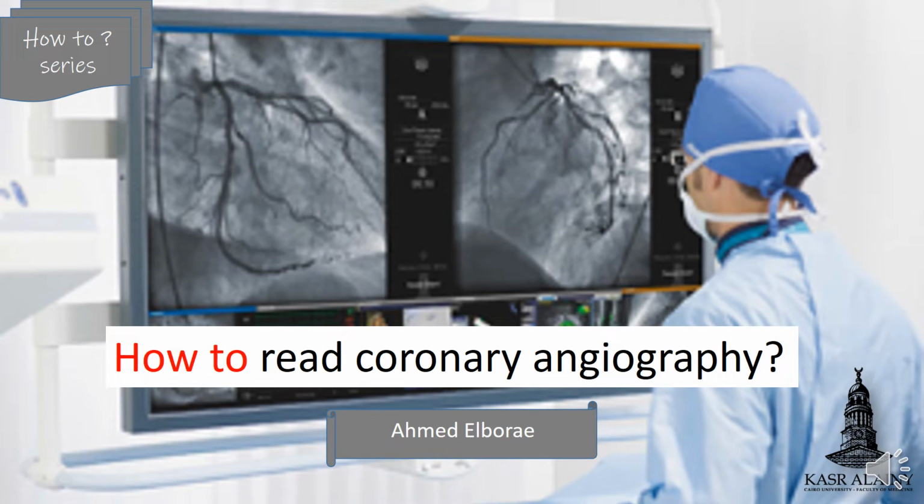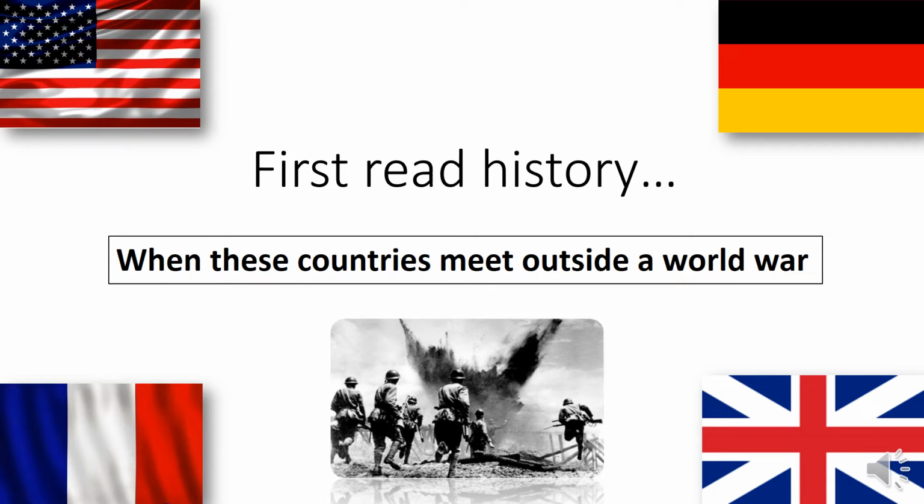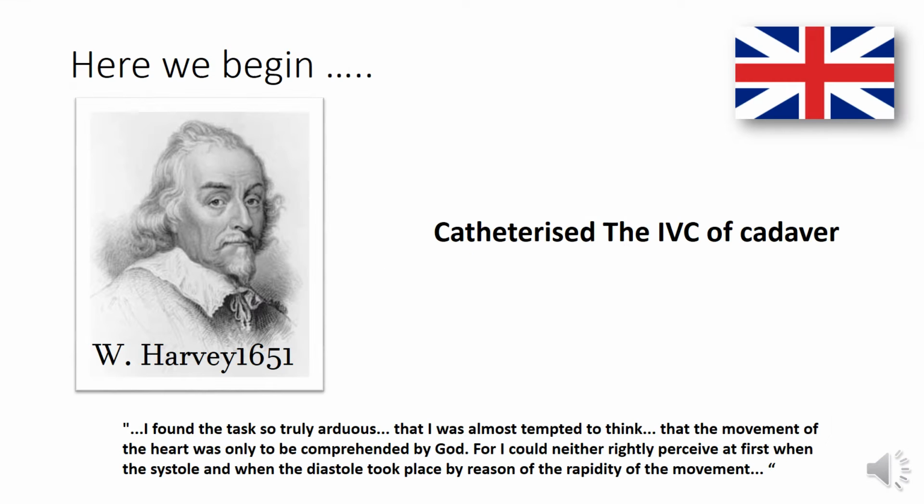We will talk today about an important topic for every cardiologist: how to read coronary angiography. First, we will start with a brief history of the evolution of nowadays coronary angiography.